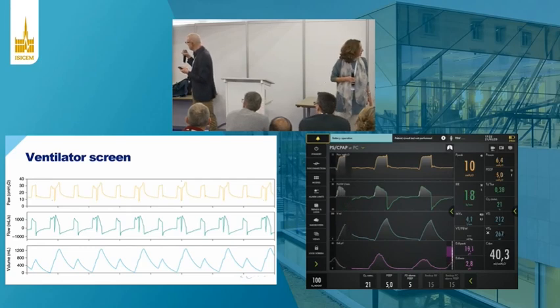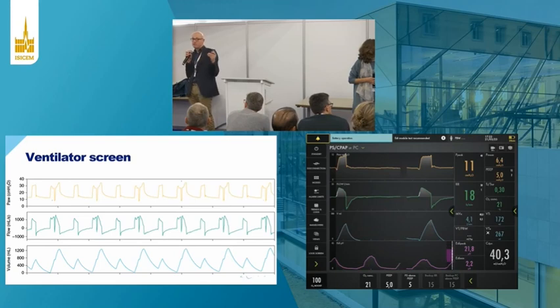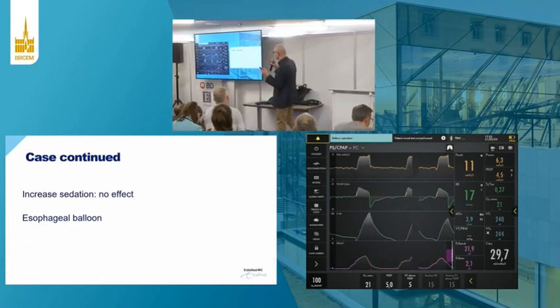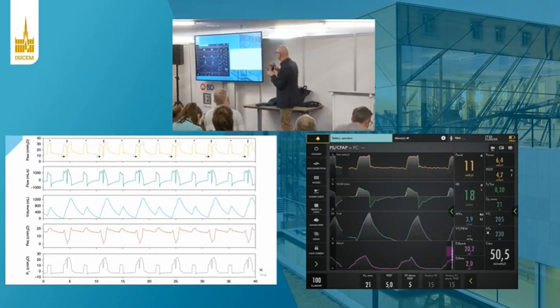And it's easier to identify right here. It's the same patient a little bit later on. So we had a 1 in 3 pattern. Now it's 1 in every 2 breaths, as you can see here. Well, it makes it a little bit easier again. Okay. I'll show you in a second, right here, with the esophageal balloon.